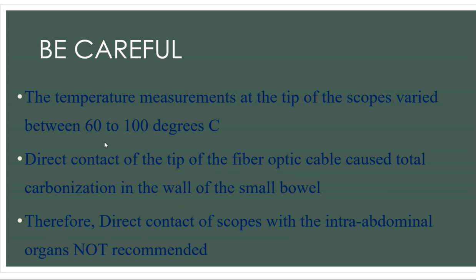The temperature measured at the tip of the scope usually varies from 60 to 100 degrees centigrade, and direct contact of the tip of the fiber optic cable usually causes total carbonization in the wall of the small bowel. So again the same message: direct contact of scopes with the intra-abdominal organs is not recommended. Whatever light source you are using, don't touch the tip of the laparoscope with any organ.